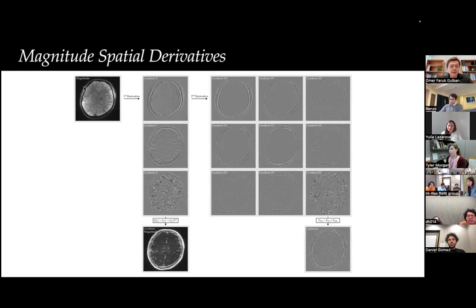In other words, there are many ways to talk about these concepts. One concept is that you start from a scalar field and you derive a vector field from it. You measure the rate of change in three different dimensions. So basically a voxel starting from a magnitude image becomes a vector valued voxel. It has three values written inside.